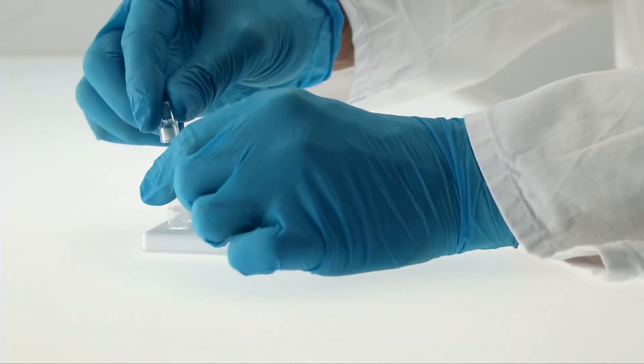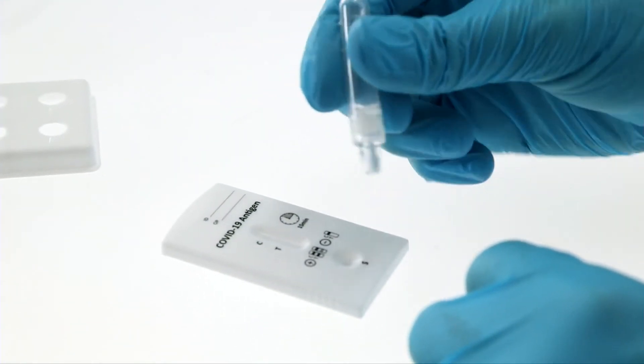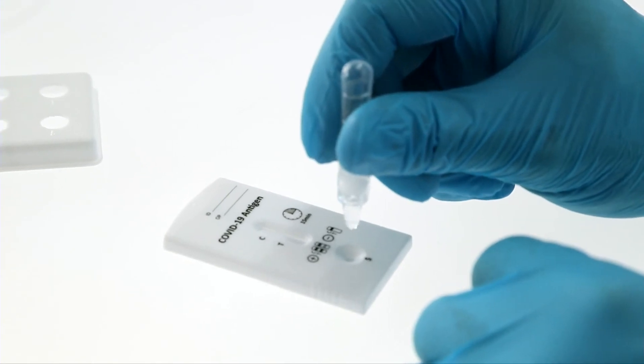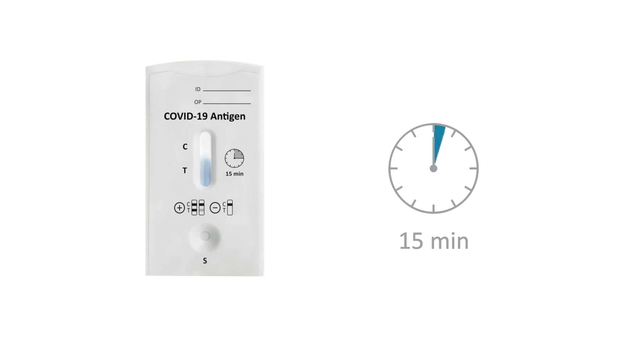Attach a dropper cap to the extraction tube, invert the tube, and transfer two drops of the extracted solution to the specimen well of the test cassette. Read the result after 15 minutes.